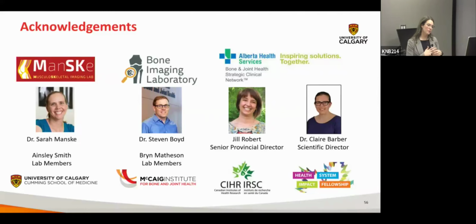Because technically, if the bone itself is being affected by the contrast, then you'll never be able to really calibrate it. With the phantom, we found that the cortical bone is not quite as affected, so I still think we could implement some type of correction, but the trabecular bone is definitely affected. So I think it depends on how you're doing that calibration.